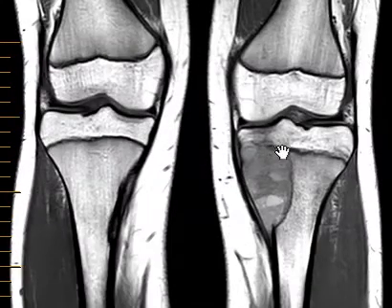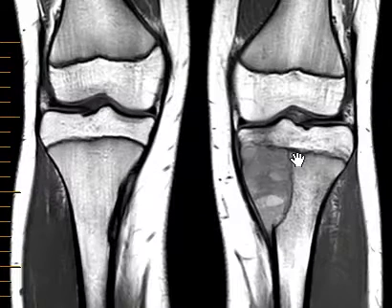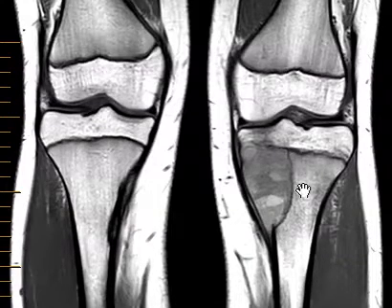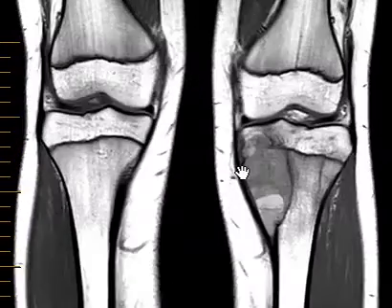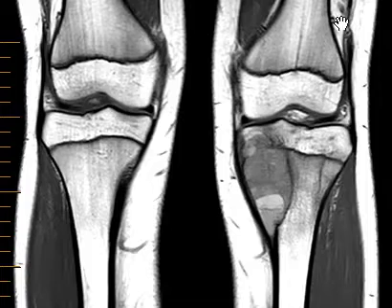This other lesion is much larger and more worrisome, but we do see that it has sharply defined margins. Instead of being foggy and irregular, we see a black line, meaning the margins are corticated. On the outer side it's pretty clean — there's no significant soft tissue component. That's highly favorable and leads us to think this may be a benign rather than malignant lesion, though it's hard to tell for sure.